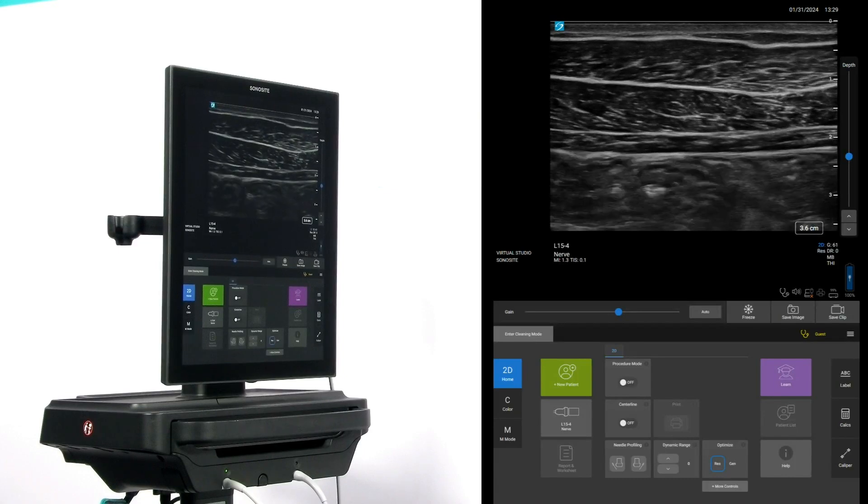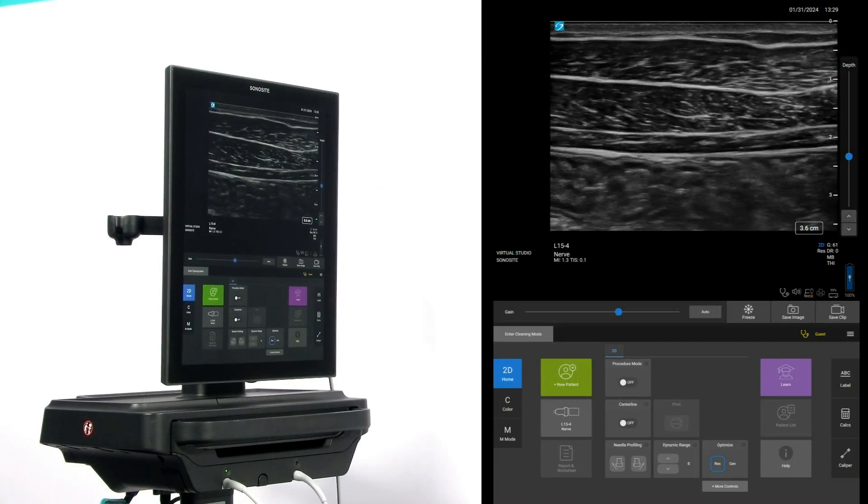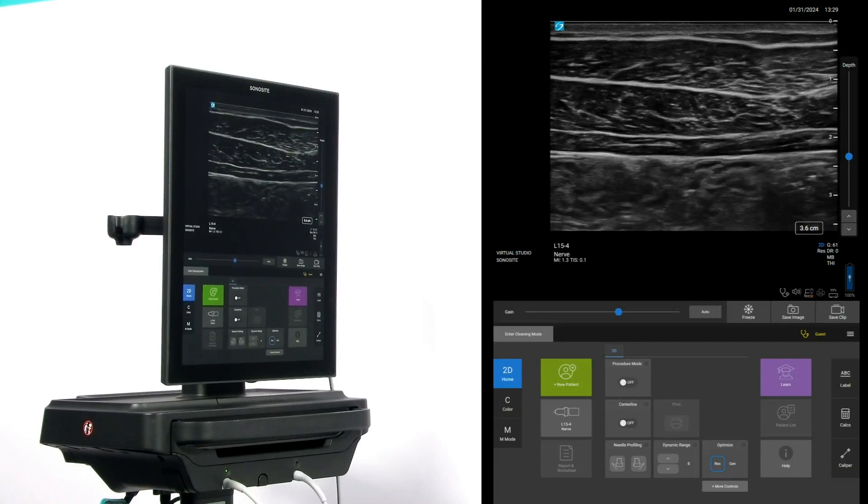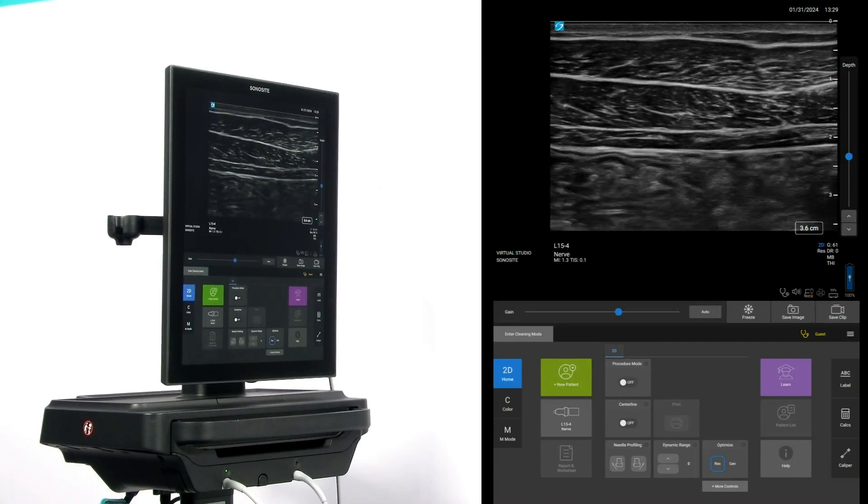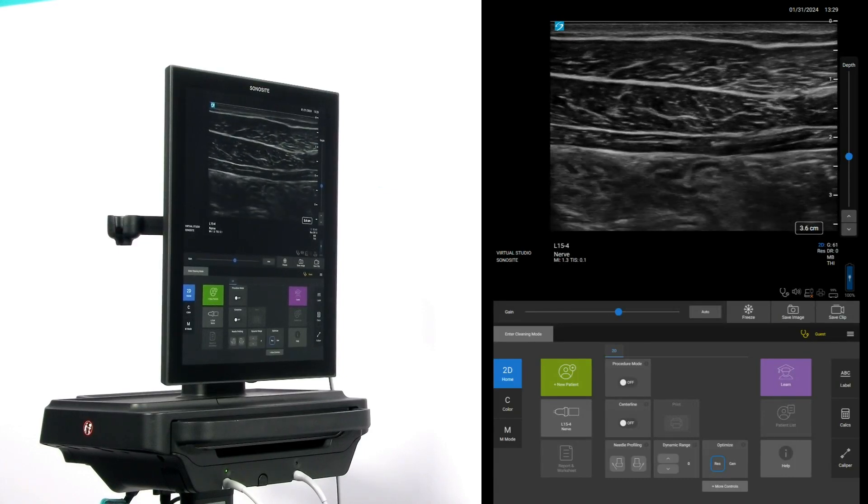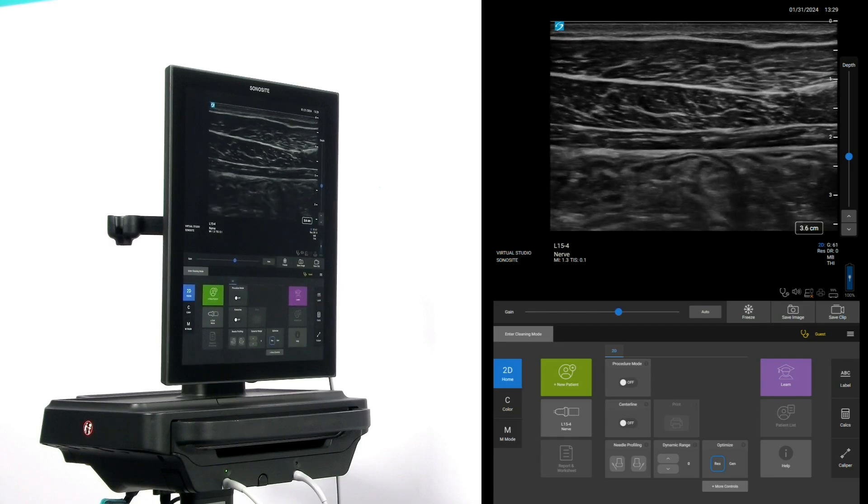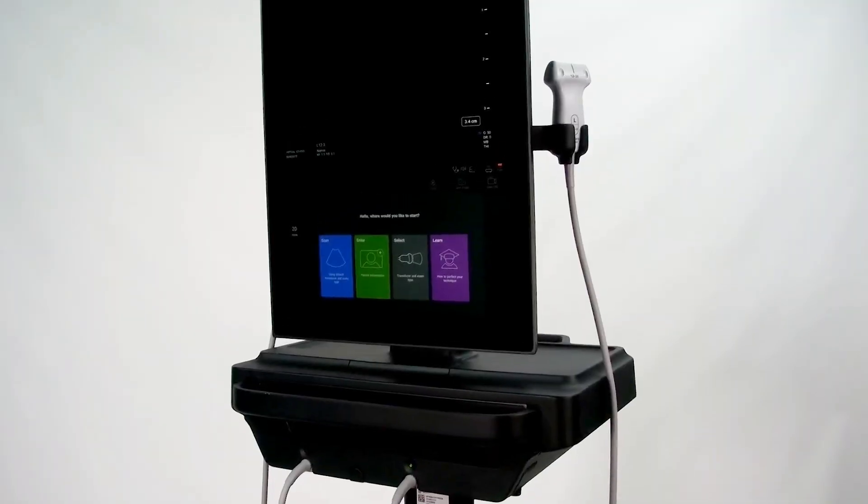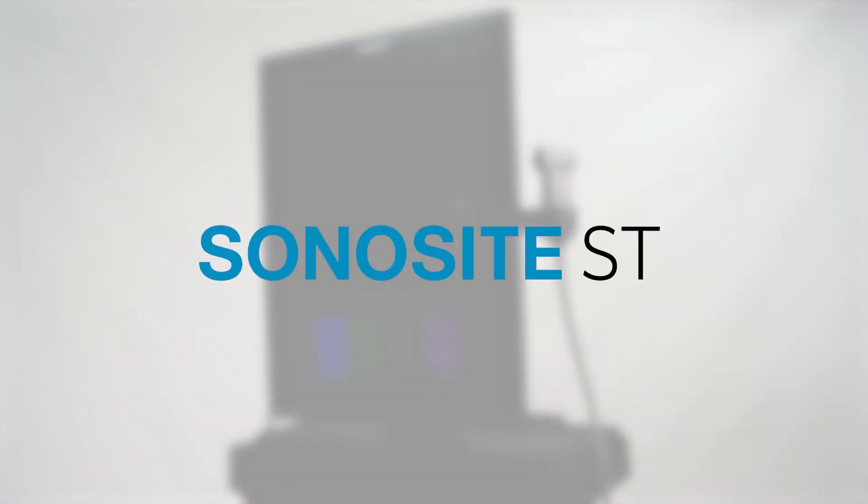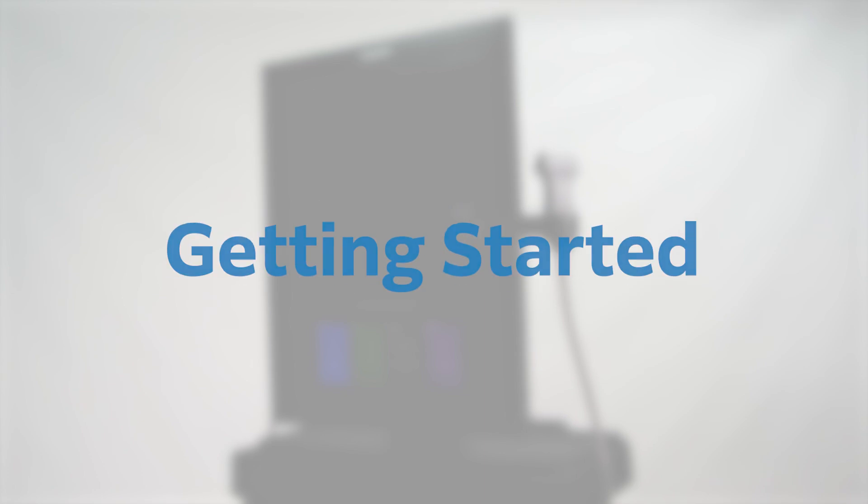Featuring an intuitive user interface for optimal workflows, Sonocyte ST connects clinicians to the needs of patients with nimble performance and precision, helping you move forward with confidence. In this video, we'll show you how to start using the system.